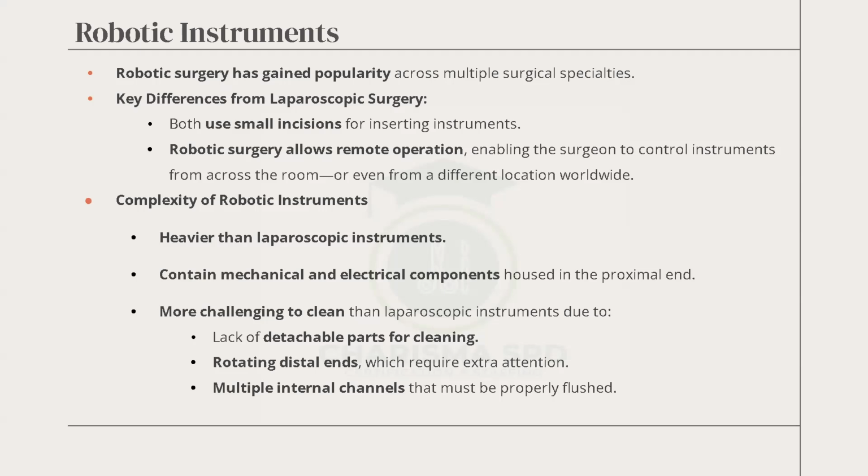So be on the lookout when you're processing robotic instruments. They use electricity and have a certain number of uses after which they become dead, so they are always being replaced. But how do we clean and take care of them? They are used in small incisions, controlled by the machine, with a screen that the doctor is watching while doing the work in there. Just as if you see somebody playing a video game, that's how robotic works. Physically, that's it.